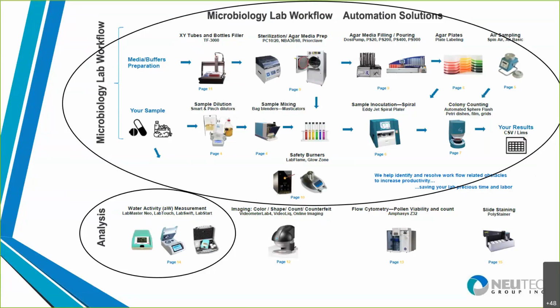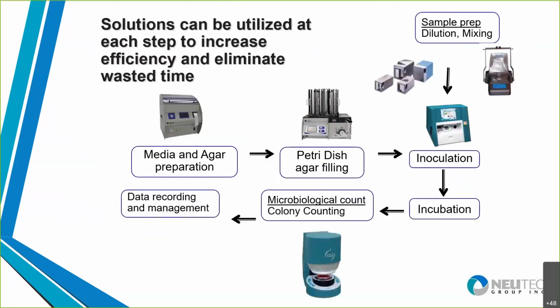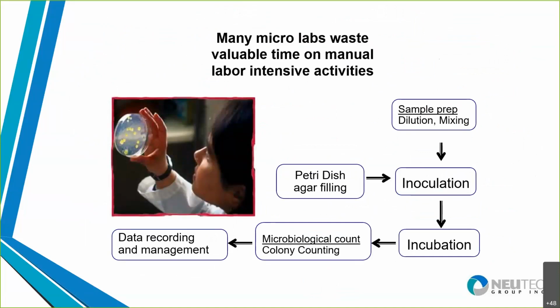But now let's focus in on microlabs. Of course, there's the requirement of being able to do this testing to look for the evidence of microorganisms. In what quantity are they present? Is it high enough to be dangerous and cause an infection?